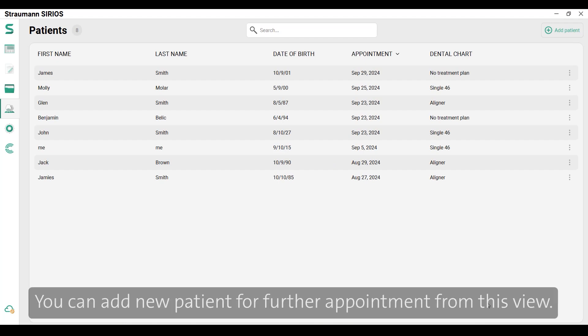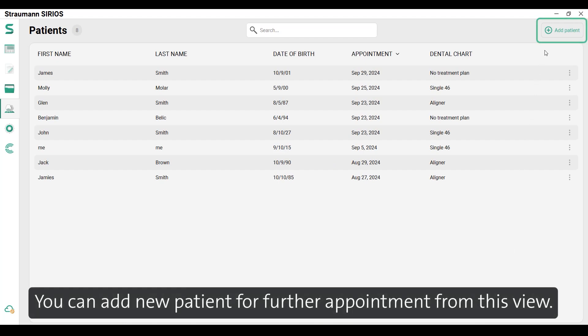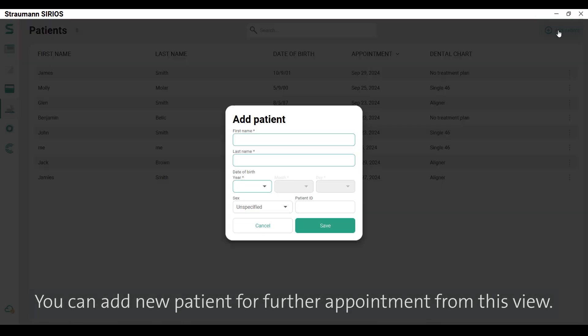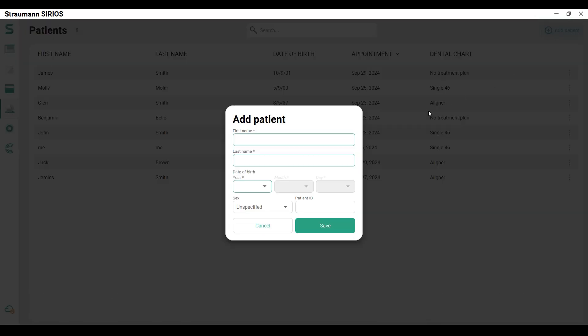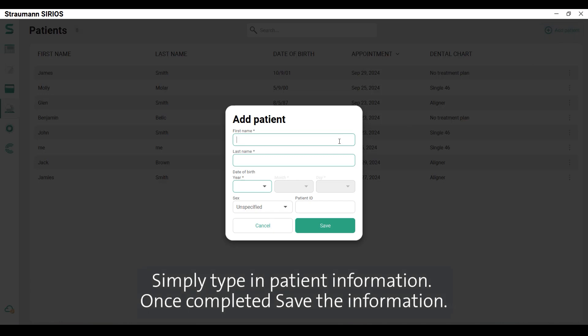You can add new patients for further appointments from this view. Simply type in the patient information. Once completed, save the information.